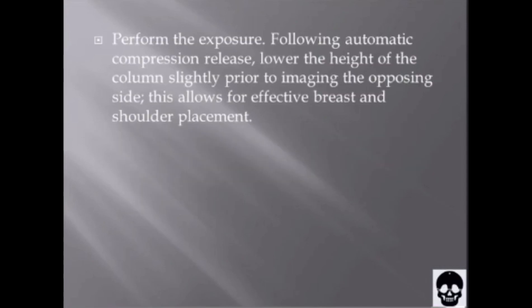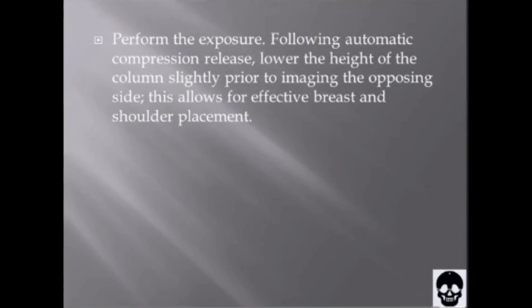The last step is to perform the exposure. Following automatic compression release, lower the height of the column slightly prior to imaging the opposite side. This allows for effective breast and shoulder placement. Always remember that mammogram images are compared for subtle changes, and practitioners need to ensure their images are of high quality and consistent with their peers.